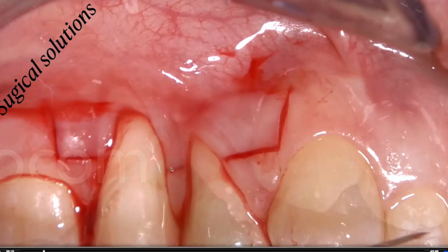Where you make the horizontal incision should be in keratinized tissue. So you have to leave at least 2.5, 3 millimeters of keratinized tissue, but the more apical you can, because the more apical you go, the wider becomes the horizontal incision. But you cannot go more apical than here, because otherwise there is not enough keratinized tissue in your papilla to be stabilized above the anatomic disepithelialized papilla.